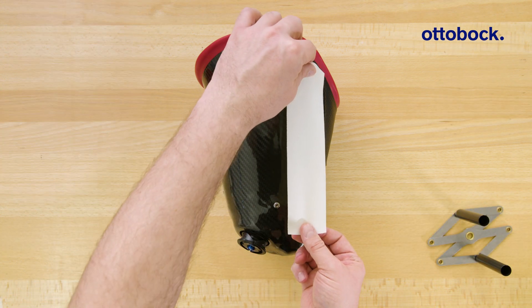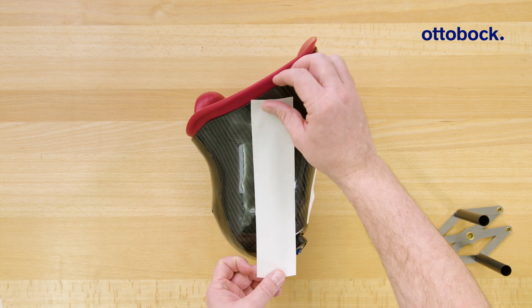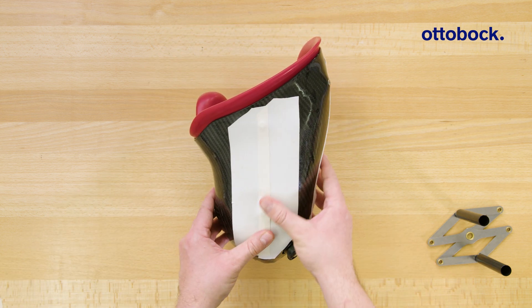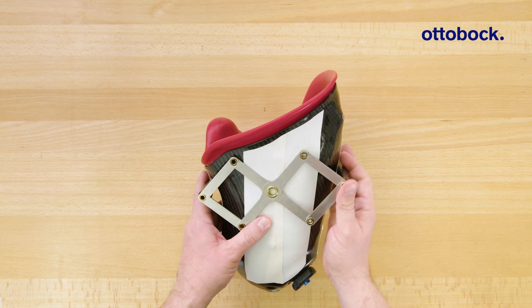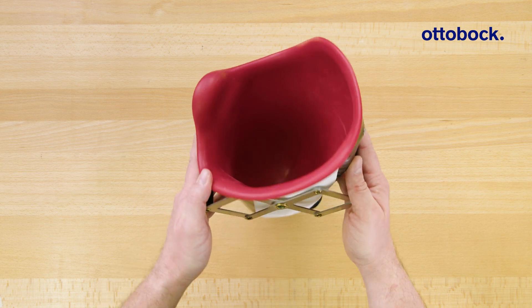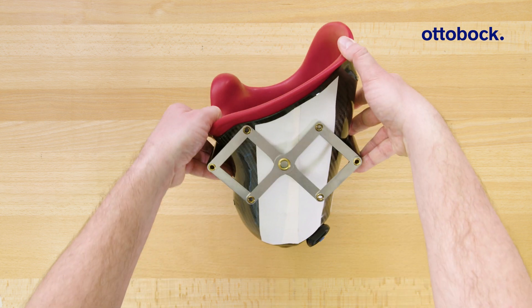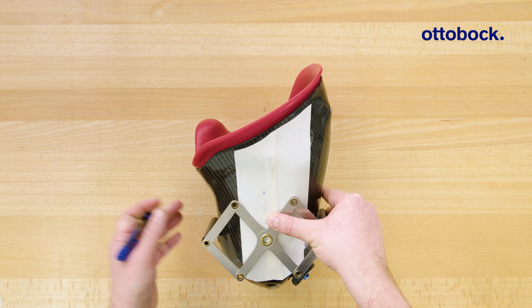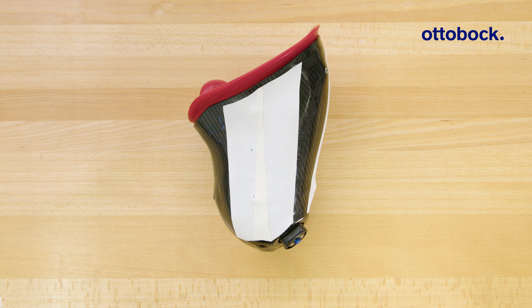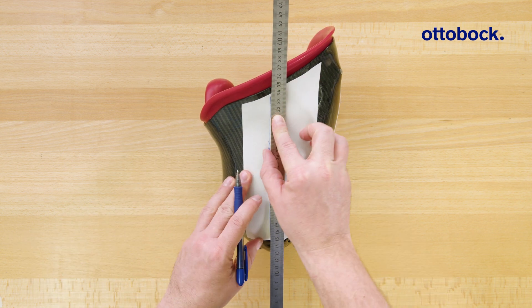Start by attaching linen tape to the lateral and front sides of the socket. Then measure the middle of the socket in the frontal plane using the 50-50 gauge. Mark a proximal and a distal point, then draw a line through them to determine the longitudinal axis.